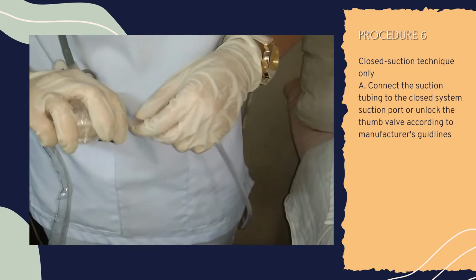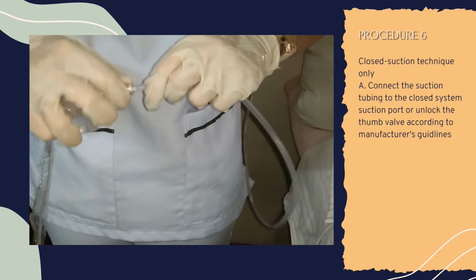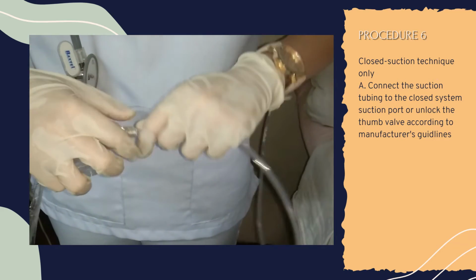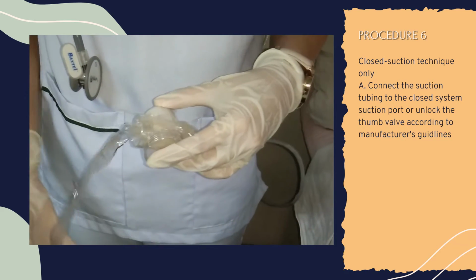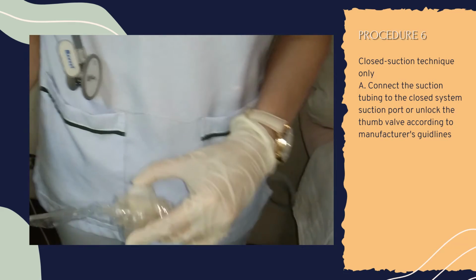For closed suction technique, connect the suction tubing to the closed system suction port or unlock the thumb valve according to manufacturer's guidelines. This readies the suction setup for suctioning.